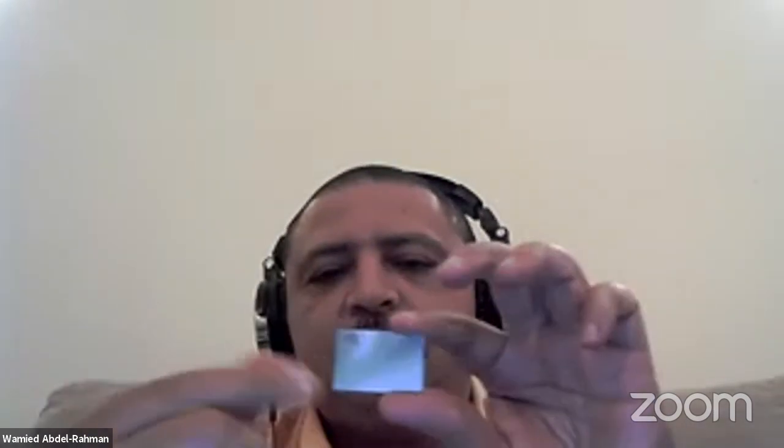I had it somewhere here. So this is a larger piece of the film, and what we do is wrap it. Although I'm now touching it with my hands, when we do dosimetry, we try to wear gloves because we don't want the film to get oily and so on, since that can affect the dosimetry. So we usually handle them very carefully.